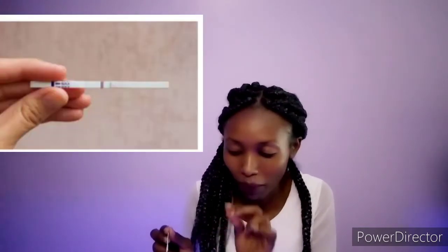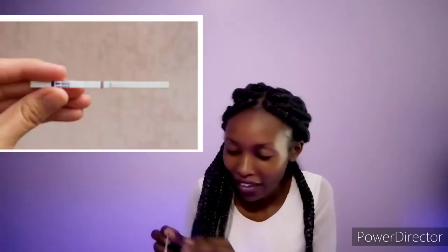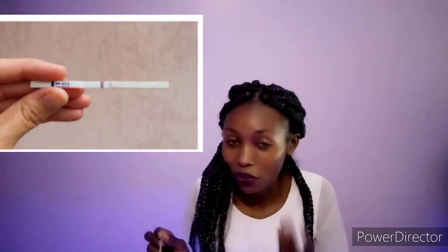Do not allow your urine to pass that black limit. There is an arrow that shows the maximum where the urine can reach, and your urine is going to analyze the hormones. If you are pregnant, there will be 2 lines, and if you're not pregnant, there will be 1 line.